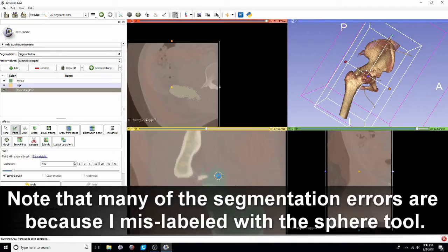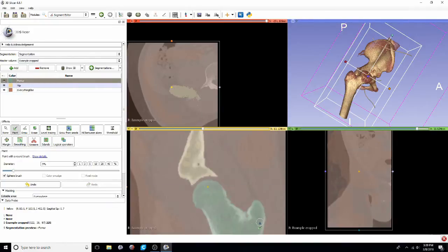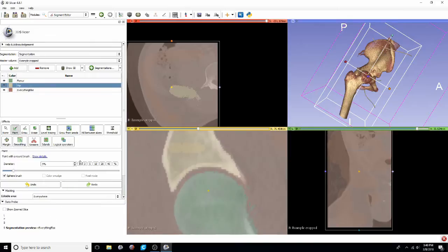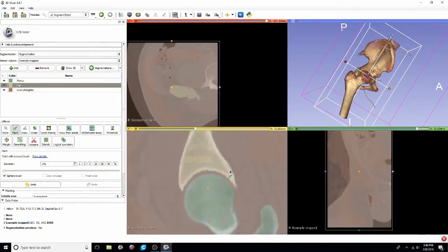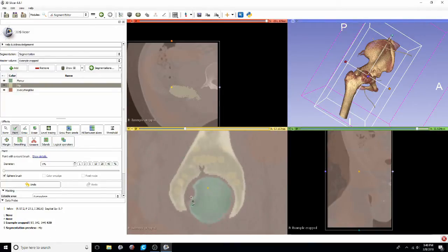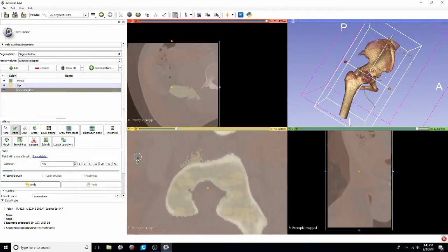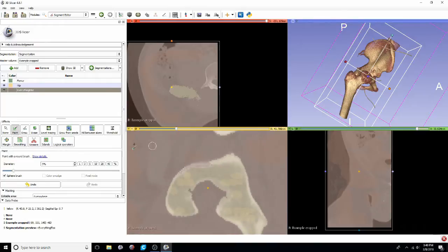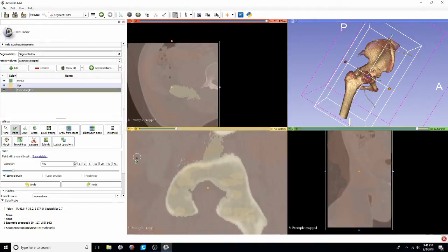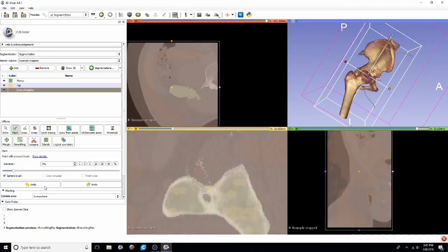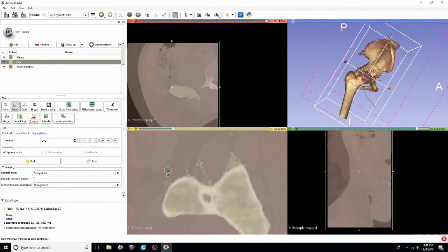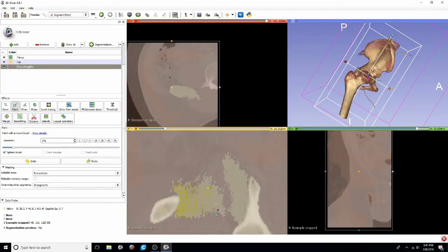mainly because we kind of segment out incorrectly. You'll be able to see as we go through these slices that most of the segmentation errors are actually because I originally labeled structures incorrectly, mostly because of that sphere tool. That sphere tool is really nice to make this process as quick as possible, but it can also cause a lot of problems and ultimately make it a little bit slower.